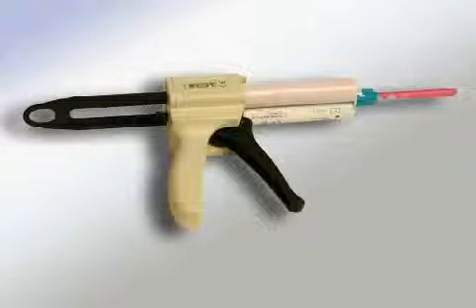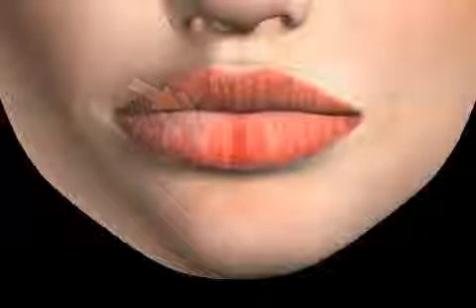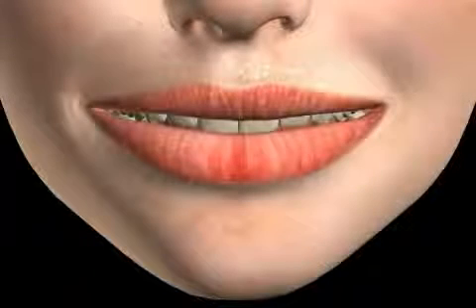Careful adherence to setting times and using pre-cast cartridges, in which materials are mixed according to specified criteria, here you see such an application tip, will provide optimal and lasting results. For you, the patient, this means a tightly fitting dental prosthesis.